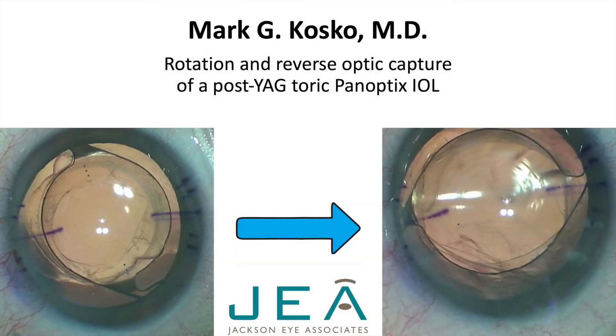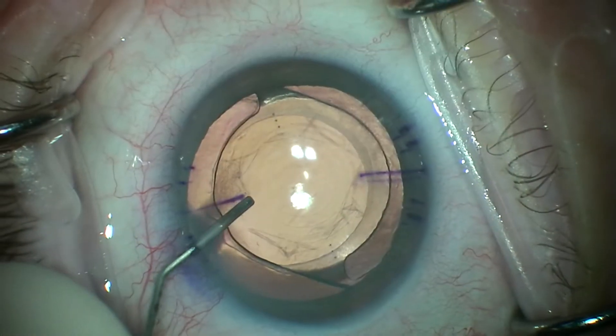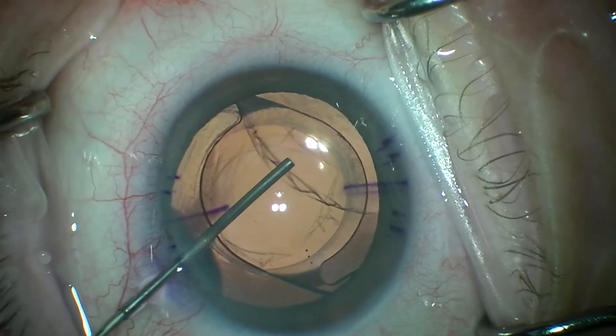Hi, this is Mark Kosko in Jackson, Mississippi. This video demonstrates rotation of a post-YAG toric multifocal and further securing of the lens with reverse optic capture.